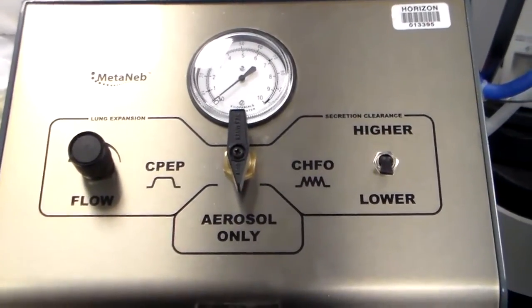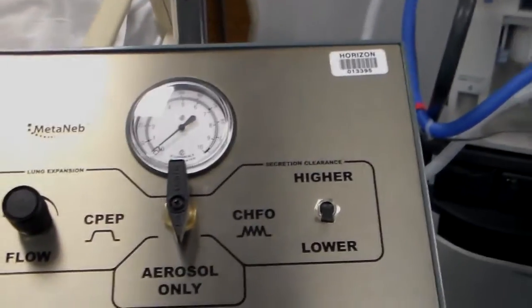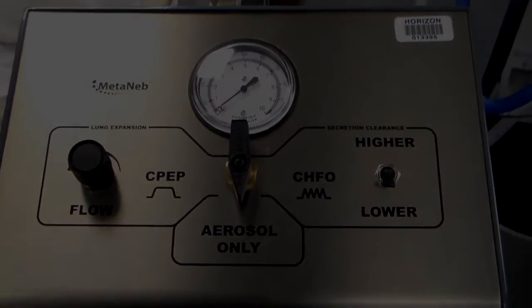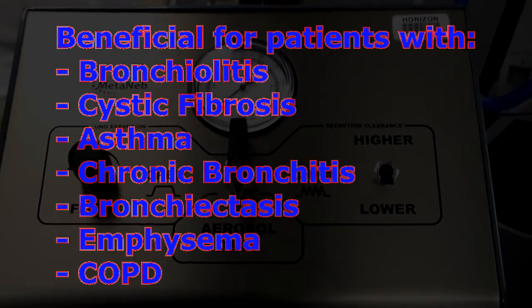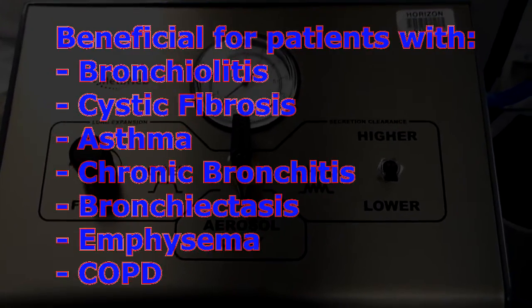Metaneb is indicated for use in mobilizing secretions, lung expansion therapy, and the treatment and the prevention of atelectasis. It may especially benefit patients with diseases such as bronchiolitis, cystic fibrosis, asthma, chronic bronchitis, bronchiectasis, emphysema, and COPD.